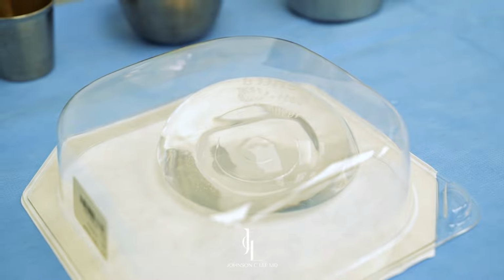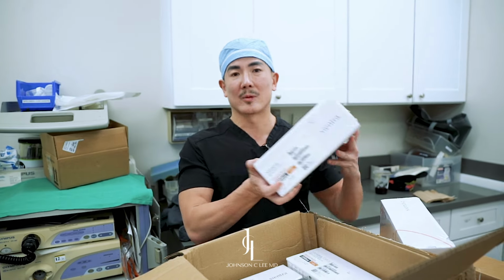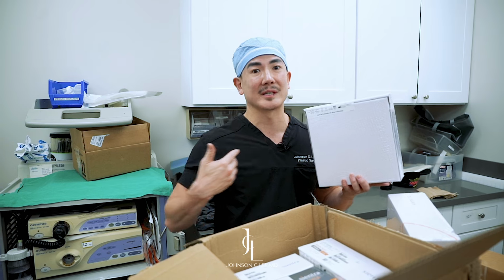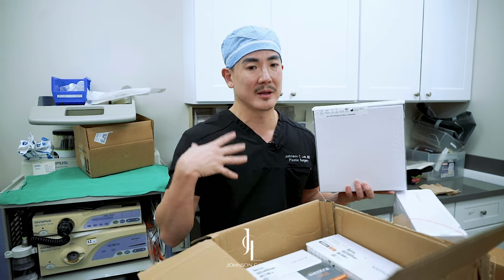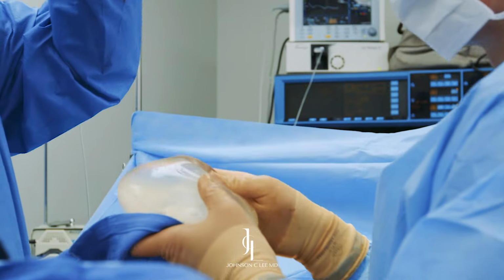And in certain cases, like today's case, I'm not exactly sure which implants I'm gonna use because I know I'm gonna use one on one side, but the patient has very different size breasts, so I'm gonna use a different size implant on the other one. So for those cases, I order a lot more implants so that I can size them and see which ones look perfect on the table for better symmetry.